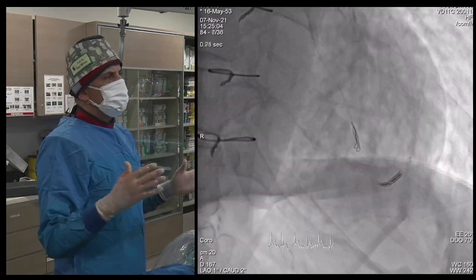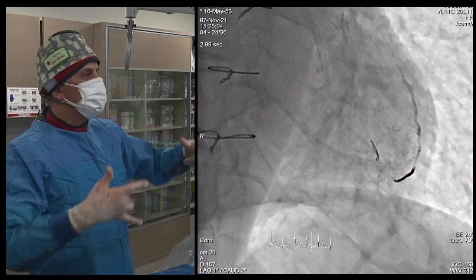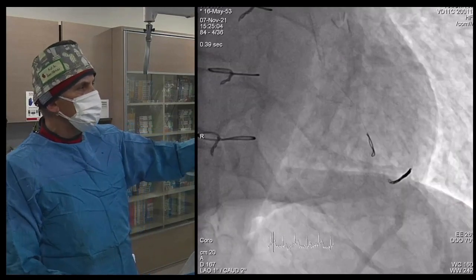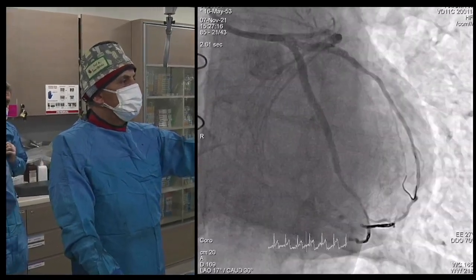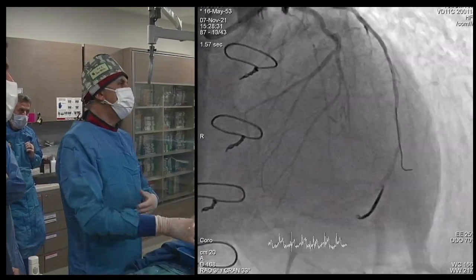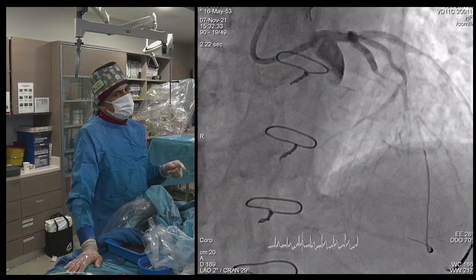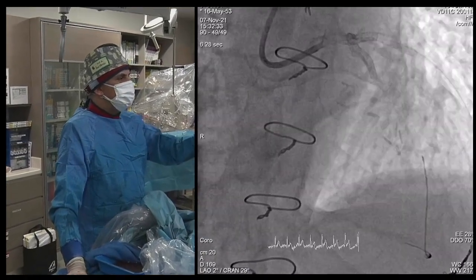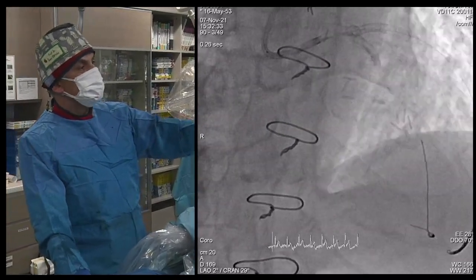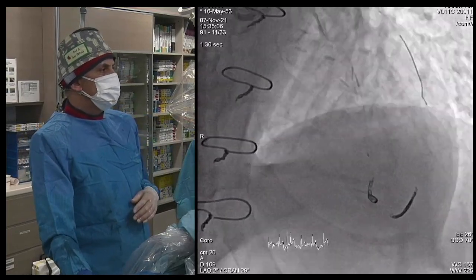We also found some bleeding from the other branch, so we went there and implanted another coil — a four-millimeter micro coil, which was large for the vessel but we didn't have a smaller one. It couldn't fully open, so we sent a wire to push the coil into place. After pushing, we achieved a good result.